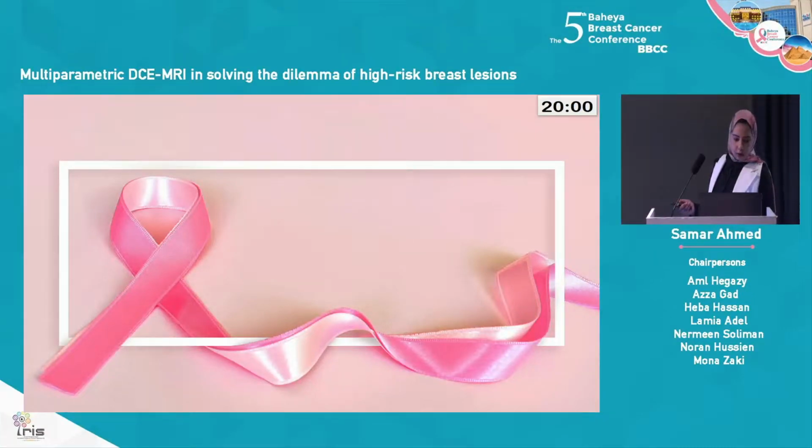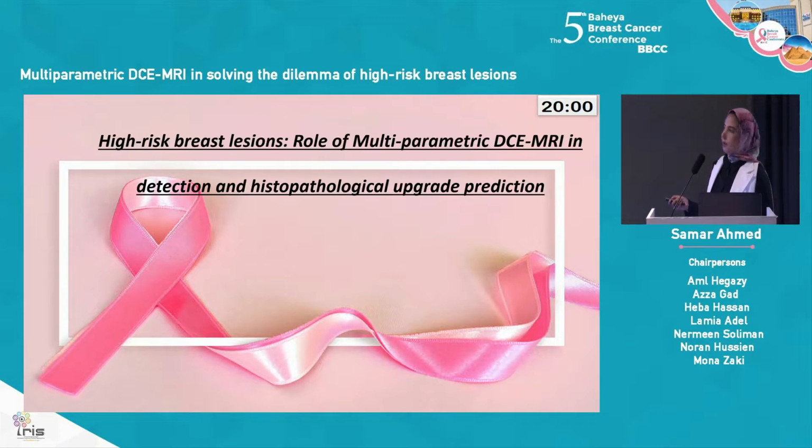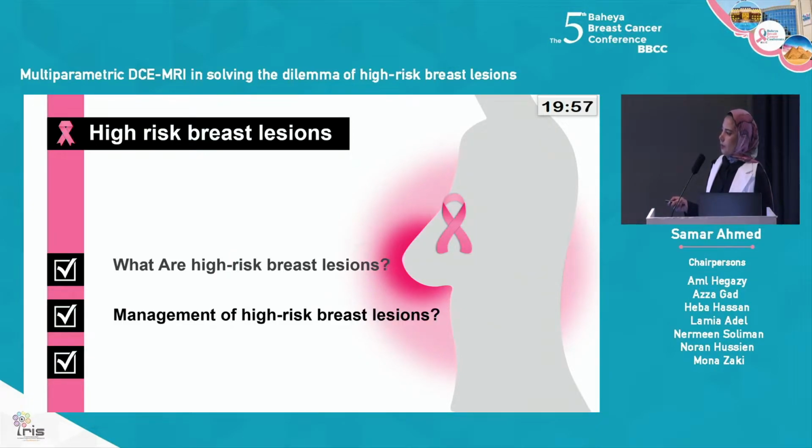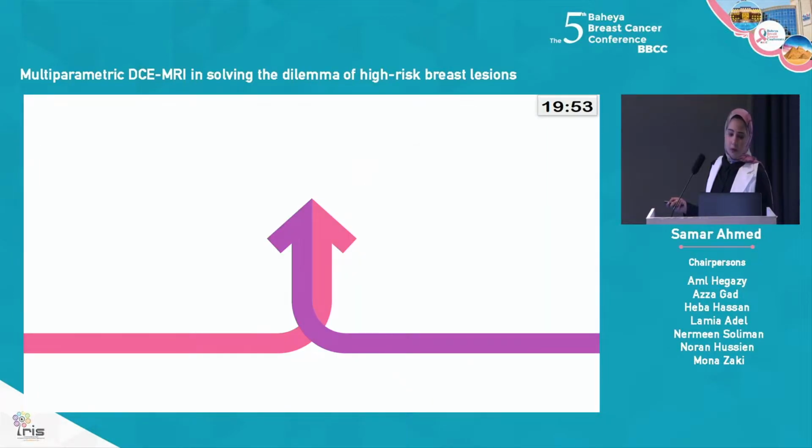Good evening. Our subject today is high-risk breast lesion, role of multi-parametric dynamic contrast enhanced MRI in detection and histopathological upgrade prediction. Our discussion today will depend on three main points: what are high-risk breast lesions, management of high-risk breast lesions, and MRI assessment of high-risk breast lesions.